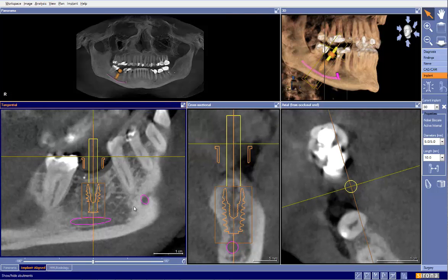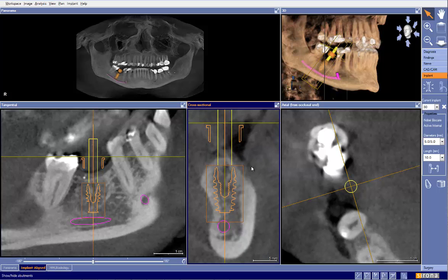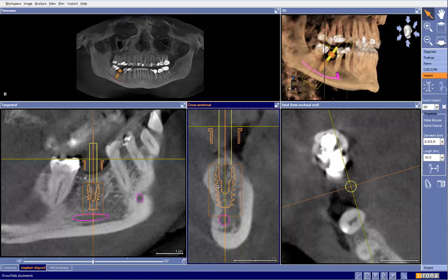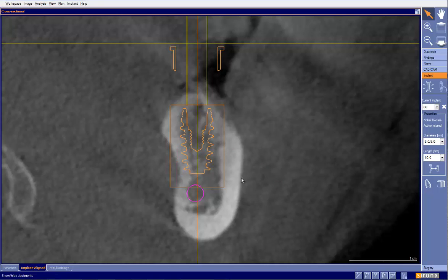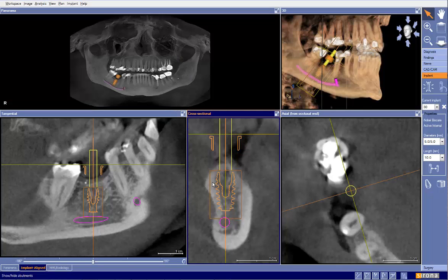Mesiodistally, we're relatively well-centered. We're plenty far away from the roots, so we're good there. Buccolingually, we're relatively well-centered. Obviously we have a lingual concavity there. I don't like this implant being this close to the lingual plate and also being so engaged in the cortical plate right there. But generally speaking, we're relatively well-centered. There's some tweaking that could be done there — just from experience, I know that.